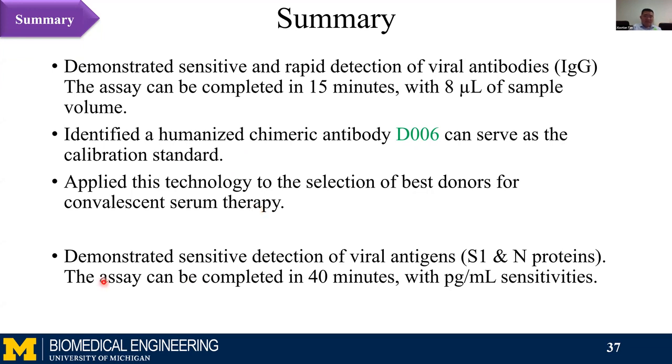We also briefly demonstrated the potential in detection of viral antigens, especially S and N proteins for COVID-19 diagnosis. The entire assay can be completed in 40 minutes with picogram per ml sensitivity, which is much better than traditional ELISA.